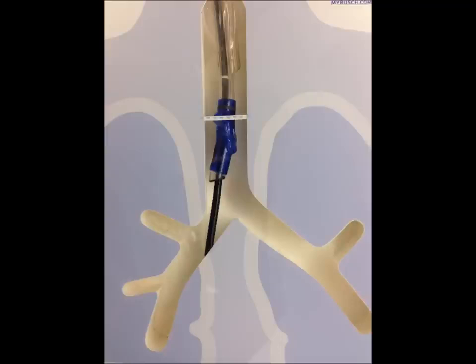In the very rare instances where you actually want to use the right-sided endobronchial tube, you can do like this illustration shows. Go down the endobronchial port, visualize the carina, make sure that the bronchoscope moves into the right bronchus, and then when you see that, then you can actually thread the tube over that way. But because this is such a short segment before the takeoff of the right upper lobe, it's very easy to either block this lobe completely, so then you're ventilating only two.